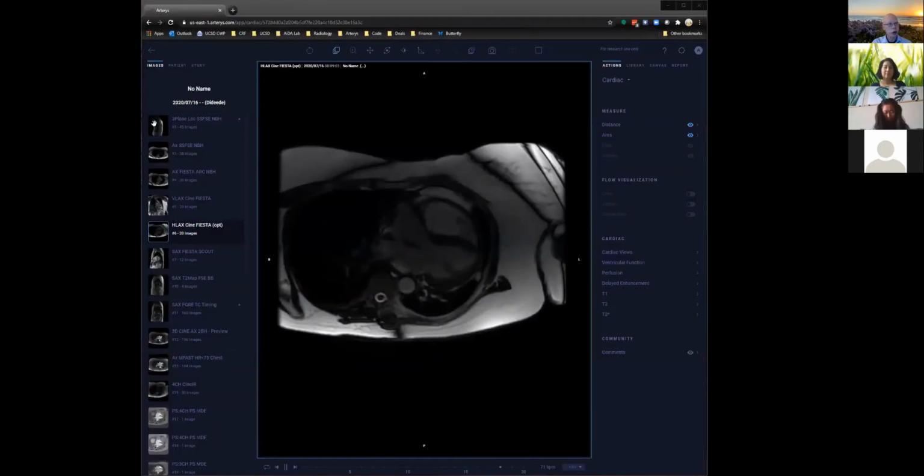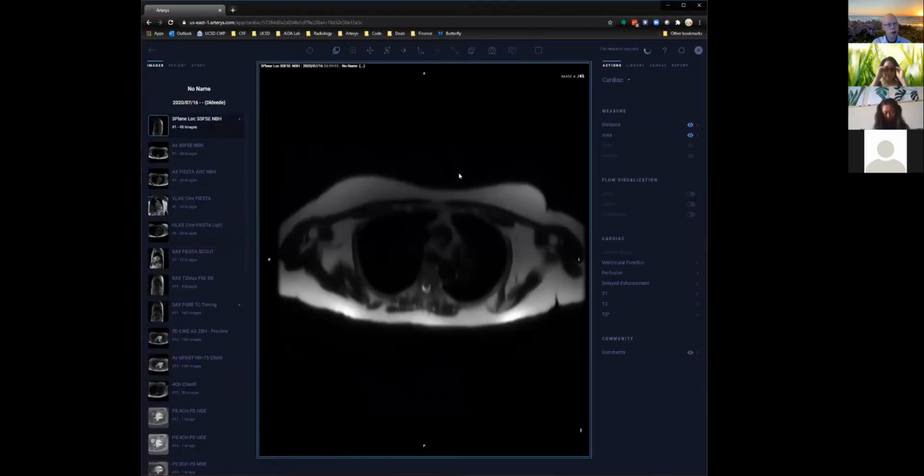And then I'll move on to a few planes, a long axis plane, a gated, and an optional horizontal long axis plane prescribed. I don't think you're sharing yet. If you were... Oh, sorry about that. That's foolish. Okay, here we go. Just so you have a feel for it.